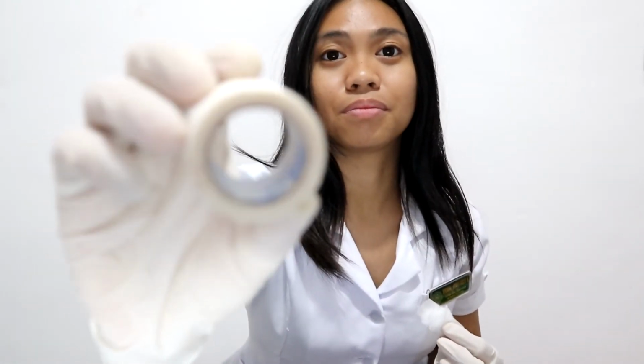Once done filling the barrel with blood, put the cotton with micropore on the site of the venipuncture before pulling the syringe out. Apply a minimal amount of pressure to stop the bleeding and secure it with a micropore. So now the syringe with blood is ready to be placed in the tube. Since I am using a vacutainer tube, this type, just simply inject the syringe into the tube and the blood will be transferred automatically.